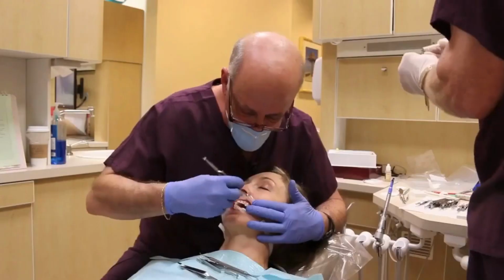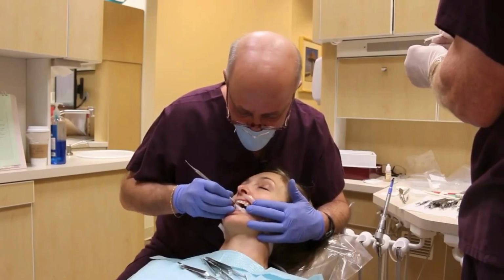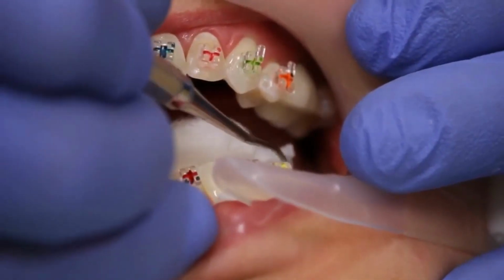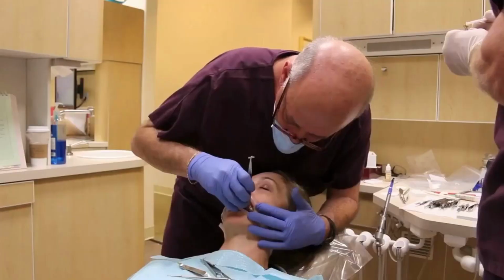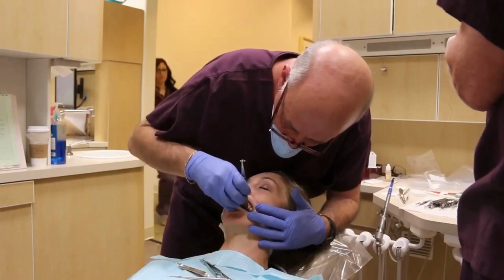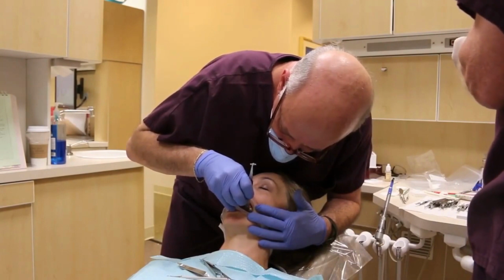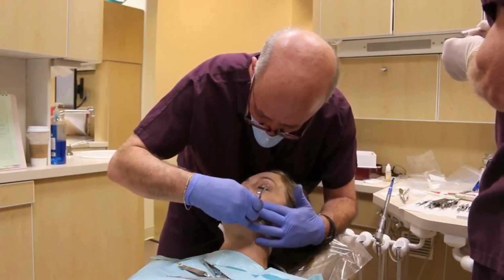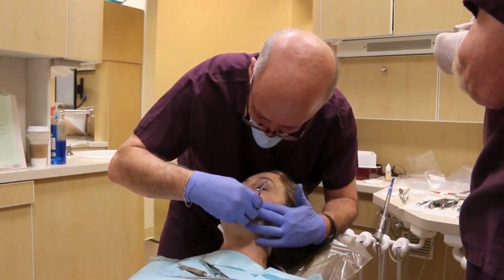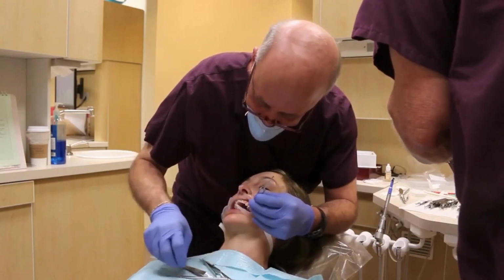As you notice, I'm using also the back of the gauge. Sometimes I use it to help me push the bracket into position, allowing me to see, have a better approach to the tooth. And also to get the correct angulation.